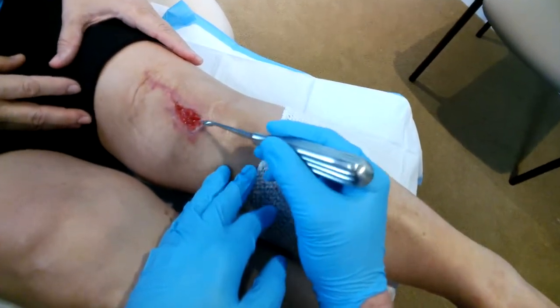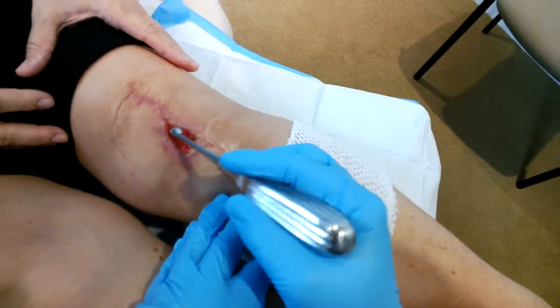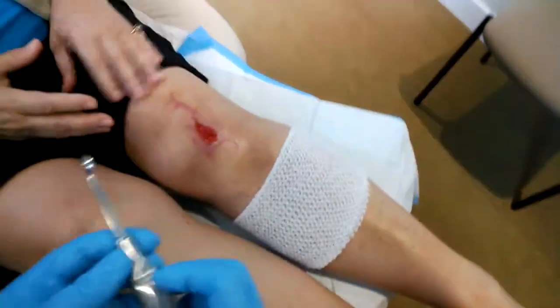That looks good there. You can just see that little bit of bleeding — it's all nice and healthy. The wound vac is going to help accelerate this wound to heal, and eventually we'll put on the skin graft.